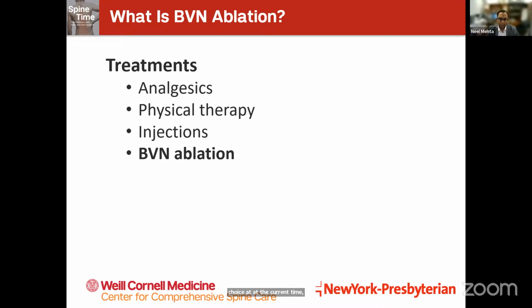And what about those that have had prior spine surgeries? Disc surgery came up as a question, laminectomies? What is the role there, or does it contraindicate it in those patients? I don't think there's an absolute contraindication, meaning the history alone doesn't exclude someone. Obviously, there has to be a safe entry point. So hardware may exclude somebody depending on where someone's hardware is. But if our access still exists and they meet the other criteria, they could still be a candidate, especially if they've had a failed surgery that may not have helped the pain they presented with. This may be an additional option for them.